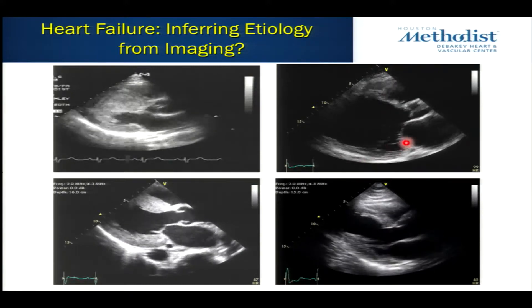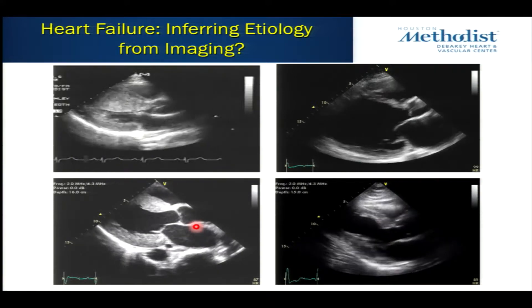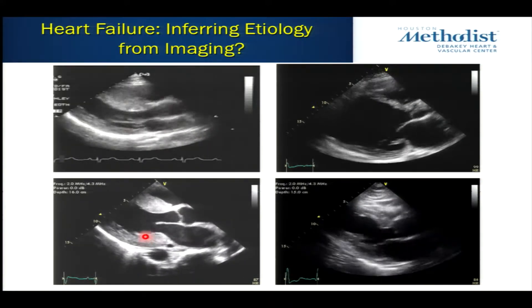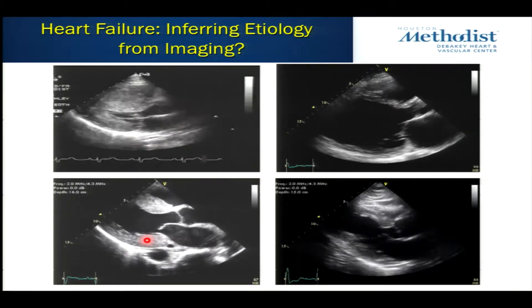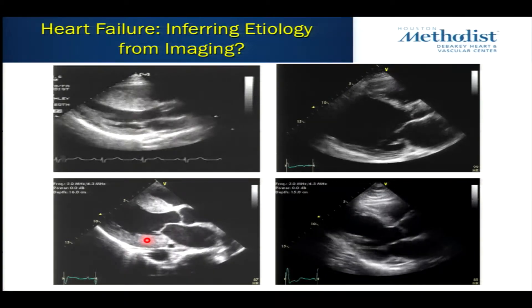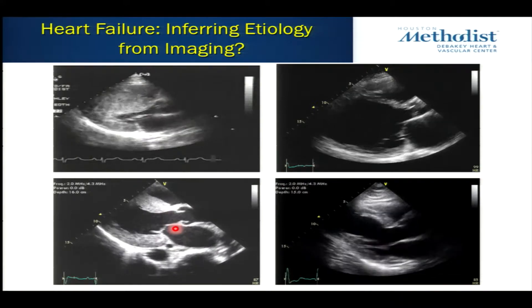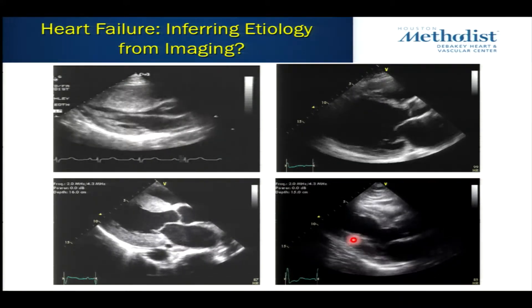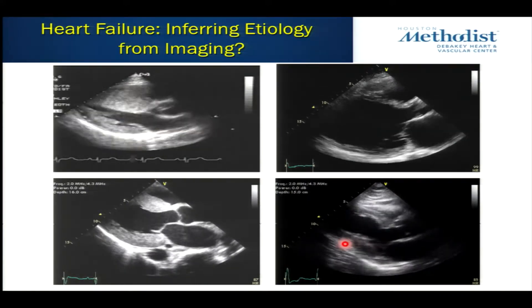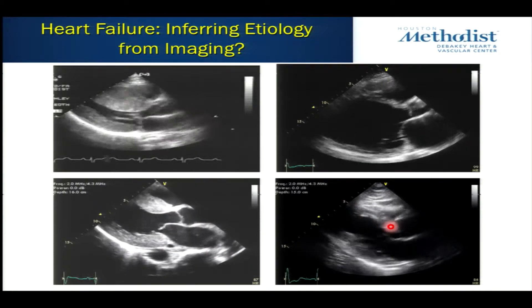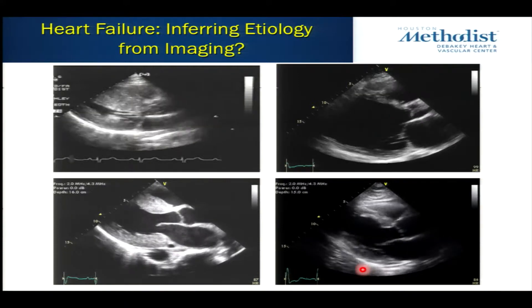This is a congestive cardiomyopathy — the heart is much bigger, barely contracting. This is an infiltrative disease with amyloid — you see the heart thicker. You can't tell it is amyloid just by looking at the heart, but as a clinician you'd look at the electrocardiogram, which has basically low voltage, and you see this hypertrophy with a glistening kind of look to it, and you suspect amyloid — most likely infiltrative disease. Versus somebody who had a previous infarction — this septum is not functioning well compared to the posterior wall, much less thickening.